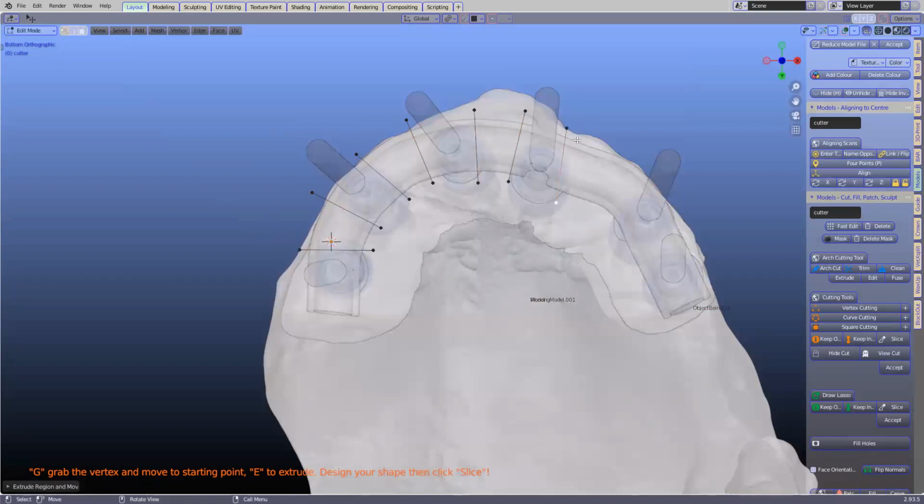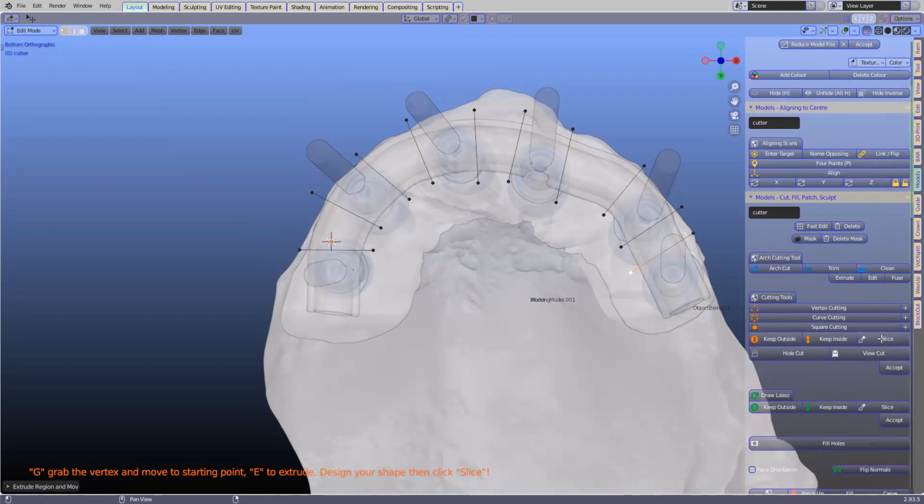We're going to mill something like this in the next week or so, and have the nylon printed as well to see whether this actually works. One would then just keep these attachments on record, and if they wear out, you scoop them out and put some new ones in. Yeah, now that would be absolutely fantastic.